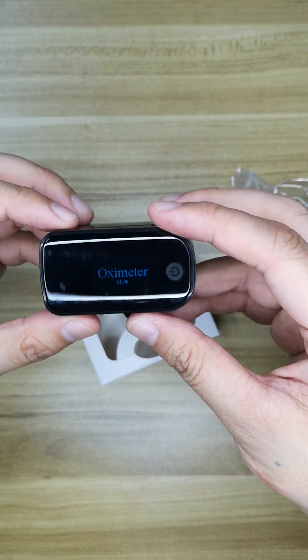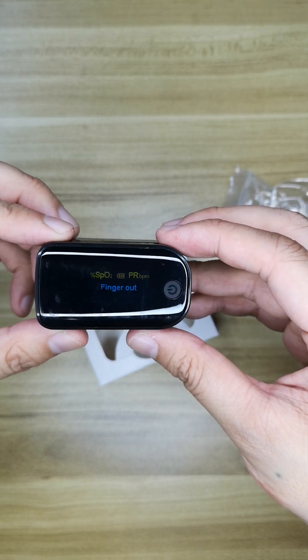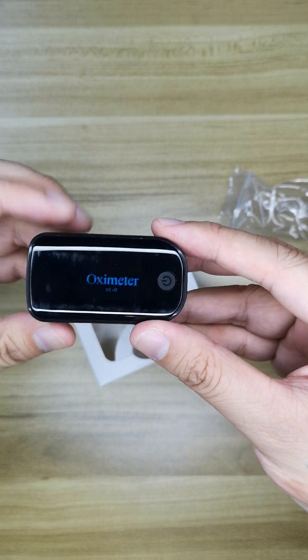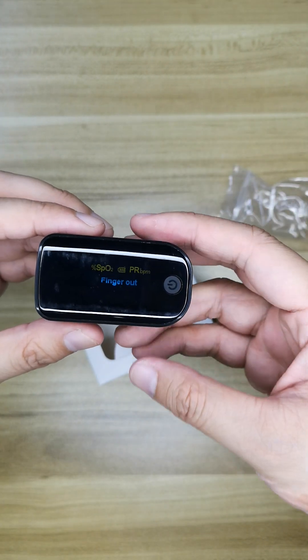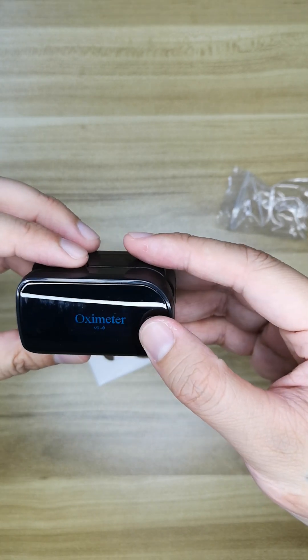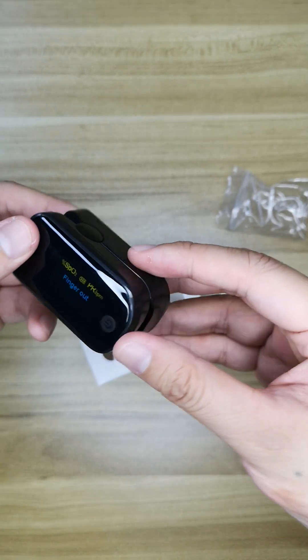Power up. And now we start up. In this video you may see some flash on the finger because I'm using a smartphone to record. But actually if you have this product you will not see the flash.